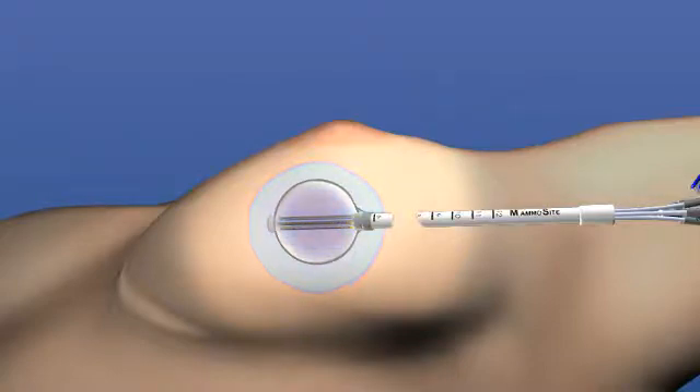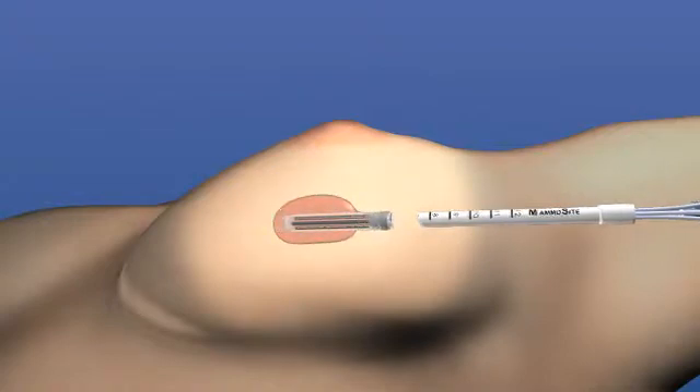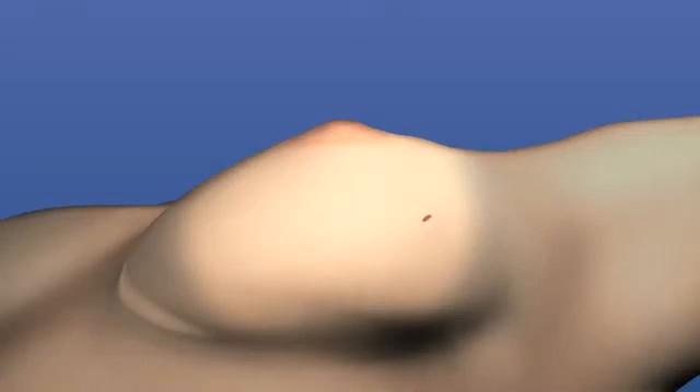After the patient receives the prescribed dose of radiation over a 5-10 minute period, the seed is removed from the balloon. After 5 days of treatment, the balloon is deflated and easily removed from the breast.